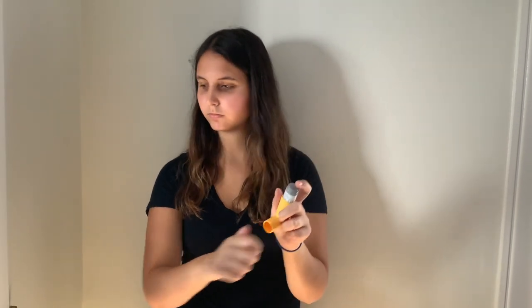If it's been a while since the last time you used it, you want to spray the contents a few times. If you're using a spacer, you then want to connect the inhaler to the spacer by putting it in through the end.